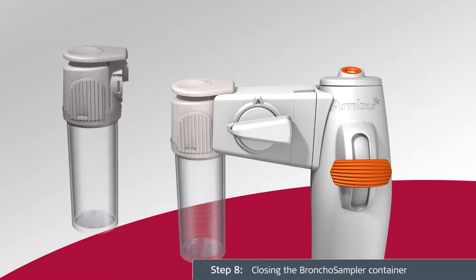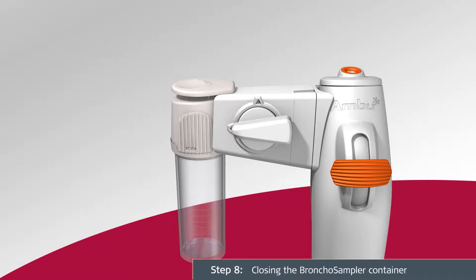If necessary, the sample can be accessed by twisting the sample container glass counterclockwise to unscrew. All handling and transportation of the filled sample container must be performed in accordance with local guidelines for transportation and handling of hazardous material.